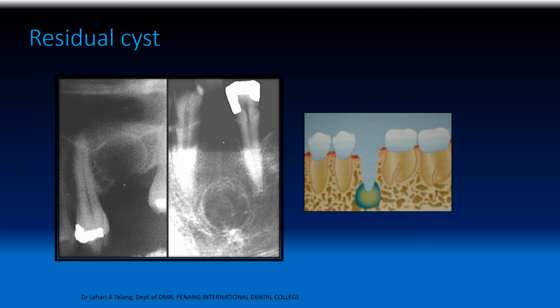This is to avoid the chances of missing a periapical pathology and leaving behind such a cystic area, which in future could become secondarily infected or lead to pain. Or in case you would want to place an implant in that area, it becomes an issue because you discover on the radiograph that there is a residual cystic area, and you would have to go back in and debride the area and perhaps look for bone harvesting and grafting.